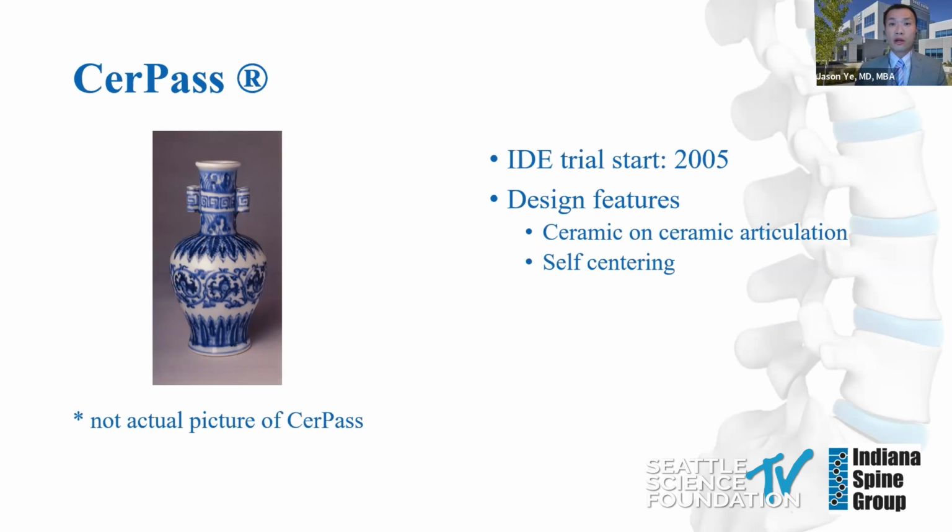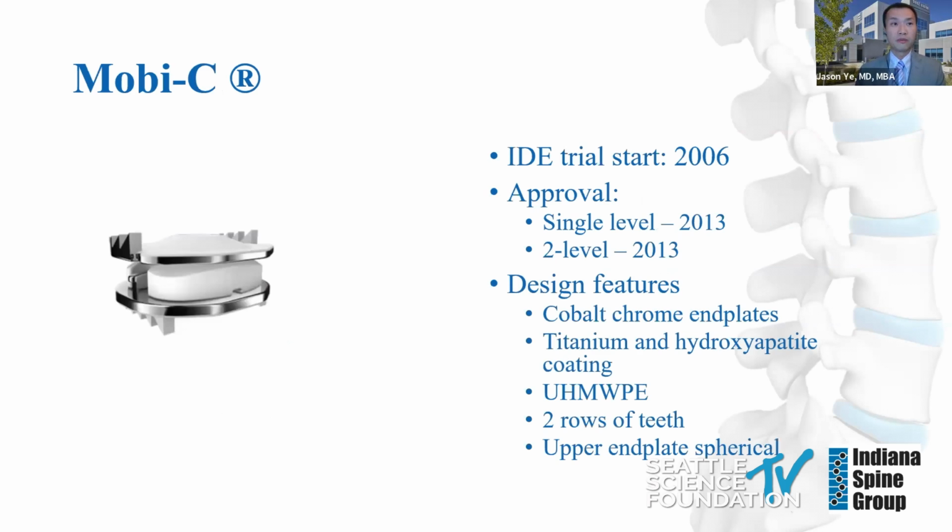Combined with the fact that wear is not a major concern and the high cost of manufacturing ceramic implants relative to metal or plastic, it is likely the company decided not to pursue this further in favor of other designs they owned.